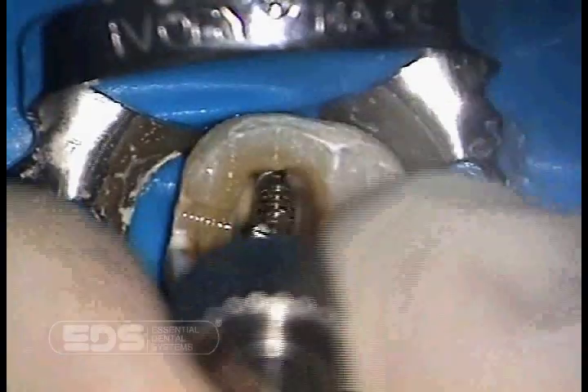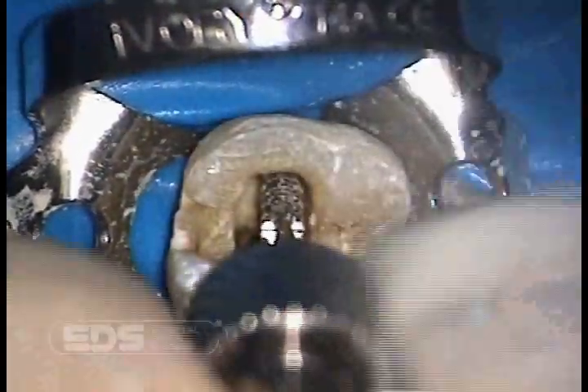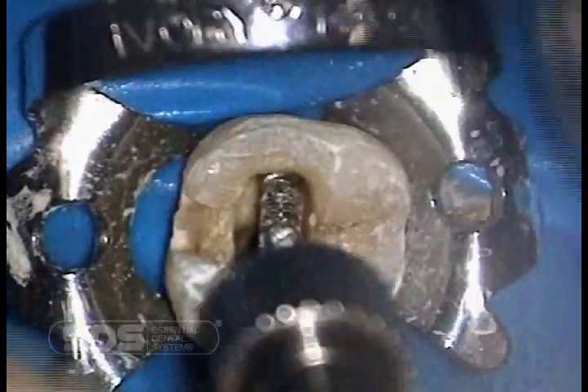Now we are trial seating the Flexi Post back in place to make sure that it fully seats. We have two wrenches: an internal wrench or an external wrench. The post is now fully seated and we remove it to prepare for cementation. We are removing it for demonstration purposes with the internal wrench.